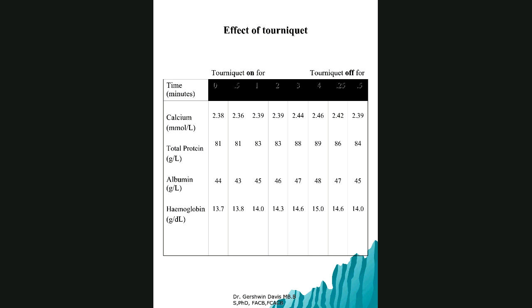You can think of, even from the laboratory request, wrong patient, wrong tube, as someone mentioned with potassium EDTA, for example. And then those are the 2 conditions, delayed separation, whether it's your potassium or your glucose. Or taking blood from an arm with an IV infusion. All of those are pre-analytical, before analysis. These things affect your result. So I'll keep quiet for a minute and then come back and we're going to talk a little bit on the tourniquet.